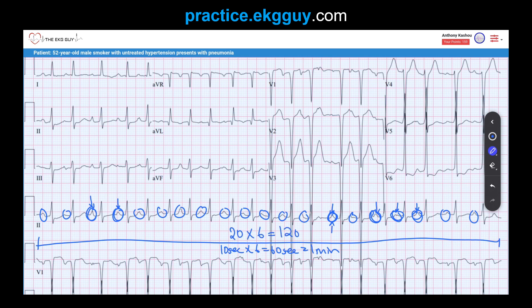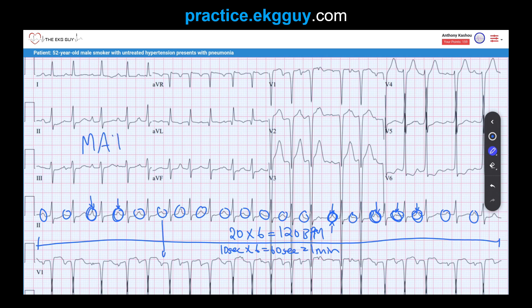Twenty P-waves times 6 is 120 beats per minute. Some P-waves are buried — looking at V1 can help distinguish those blended with the end of T-waves, especially with faster rhythms where the R-to-R interval narrows. Given an atrial rate over 100 bpm, more than three different P-wave morphologies, and an irregularly irregular rhythm, this should make you think of multifocal atrial tachycardia — and that's exactly what's present here.